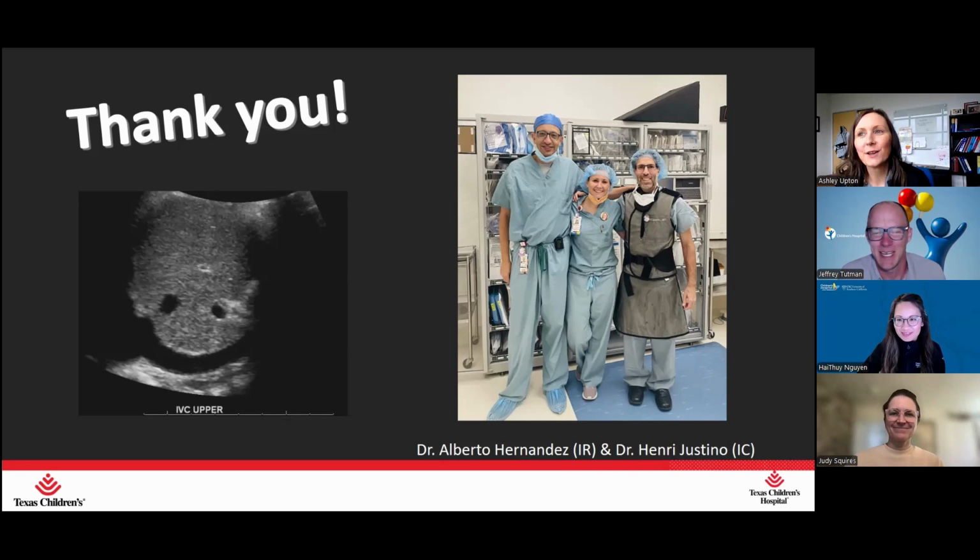Great question. So for any patient that there is a concern about portal hypertension, we will always do at least a liver Doppler, a full liver Doppler. So we'll do hepatic veins, portal vein, hepatic artery, aorta, IVC, all the things. Elastography, we're leaving up to the clinicians, how they want to use it. So if they want it, that's great, but if they don't, we're not forcing that as part of the portal hypertension workup. I personally think it adds a lot of value, but we are leaving it up to the clinicians for that part.